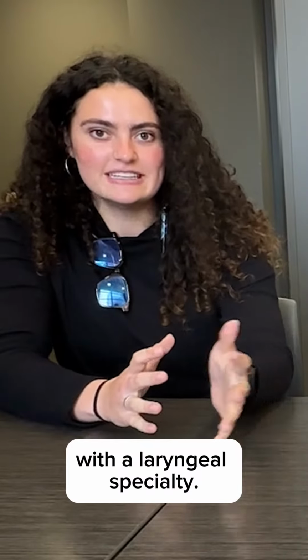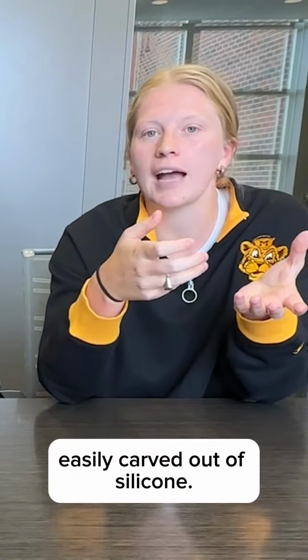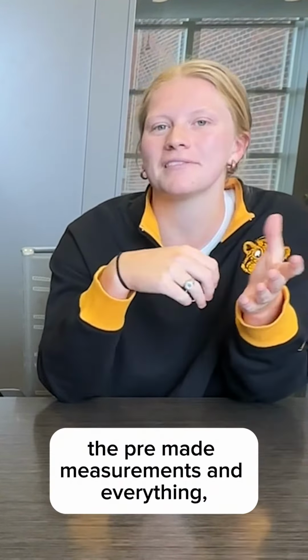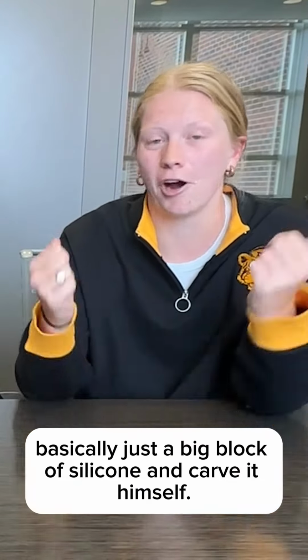To give you some background on what we're doing, we're working with our client, who's a surgeon here at the University of Missouri with a laryngeal specialty, and we are redesigning the way that the implant he's using is being manufactured. Previously, there was a device that was easily carved out of silicone, and it had pre-made measurements and everything. That was discontinued, and so now he just has to take basically a big block of silicone and carve it himself.